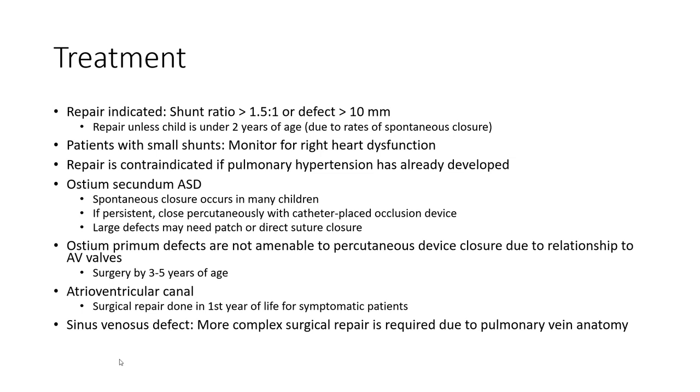Ostium secundum ASD: spontaneous closure occurs in many children. If persistent, close percutaneously, with a catheter placing an occlusion device. Large defects may need patch or direct suture closure.